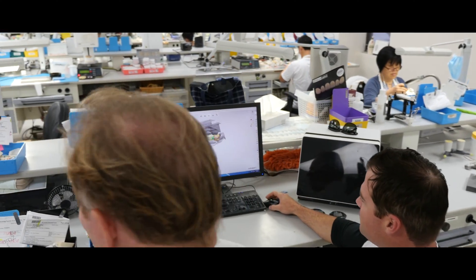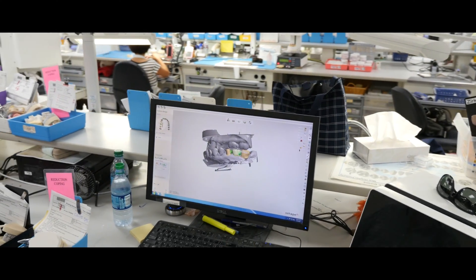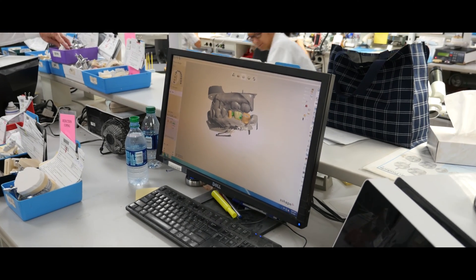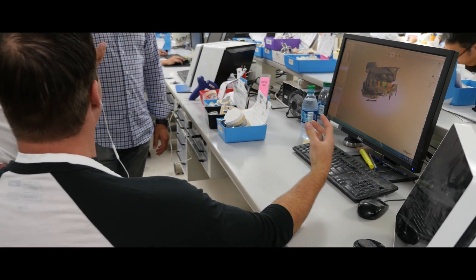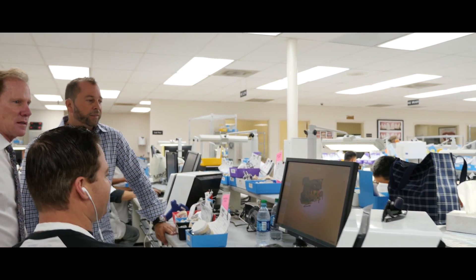I just don't understand why every dentist doesn't just buy a scanner. Oh, so they send us a file — it scares them. I mean, it's ridiculous. Plus it'd be easier for reductions and stuff, because then they have the model at their office still right there. They can do it themselves — rescan it, send it back over. That's it.